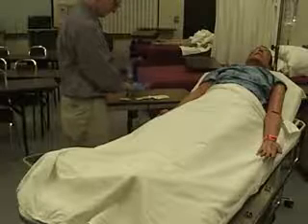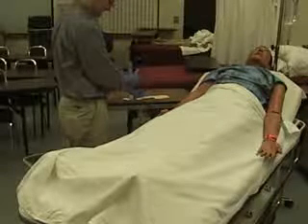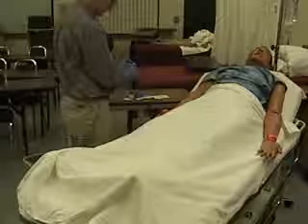You've gathered your supplies, you've found a site, now comes the fun part. First and foremost, relax. Get a chair and sit down if you need to. Talk to the patient. This can help calm their nerves and yours as well.